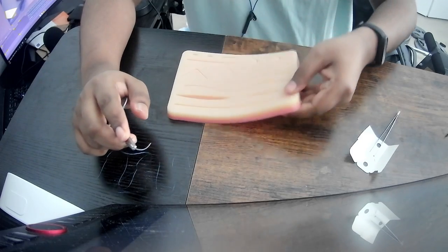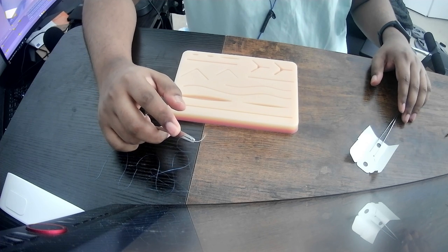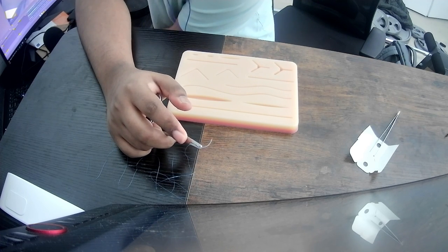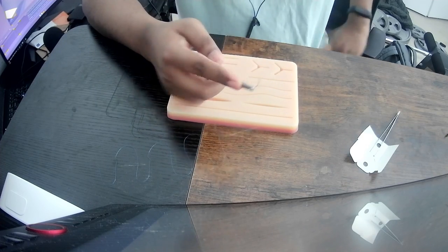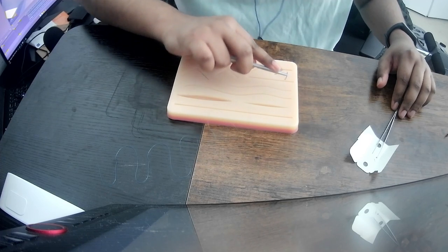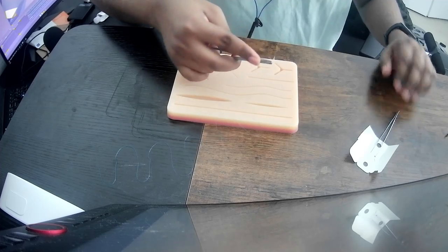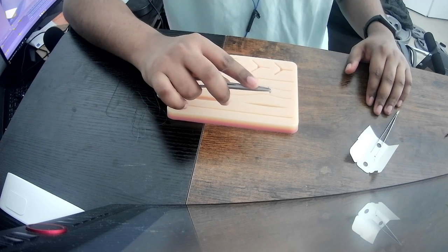Now, this is going to seem kind of silly and pretty low key of me to do this, but I stand by it. There are no sterile issues here. When you're working with raw poultry or pork, you have to be mindful of what you're touching and cleaning your tools. It also costs money to keep buying them, and you have to keep it refrigerated. It's not very practical for the volume of practice that I would recommend you get.